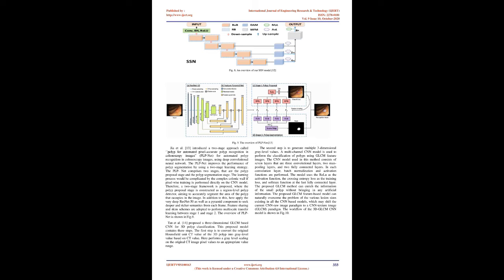The architecture of the proposed network includes fully 3D layers that enable the network to be fed with multi- or hyperspectral images or even video streams. Moreover, there is a dice prediction output layer. The architecture of UNet is shown in Fig.7.